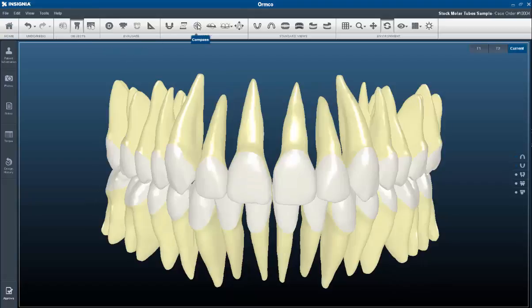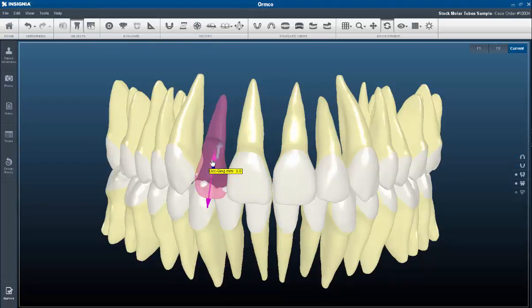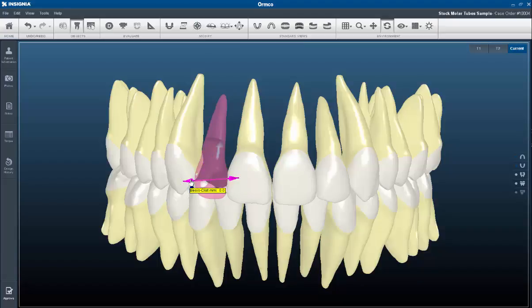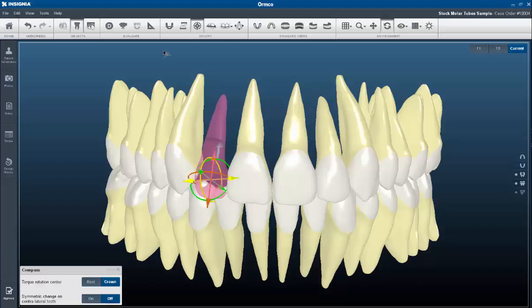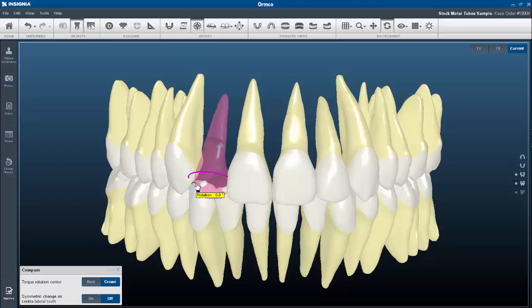The Compass tool is also updated. It is now easier to choose the correct axis within the compass tool. When selecting an axis, you will note that the other axes disappear. We have also added the ability to change the centre of rotation from crown to root when adjusting torque.